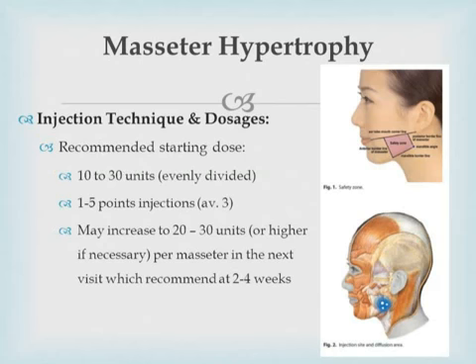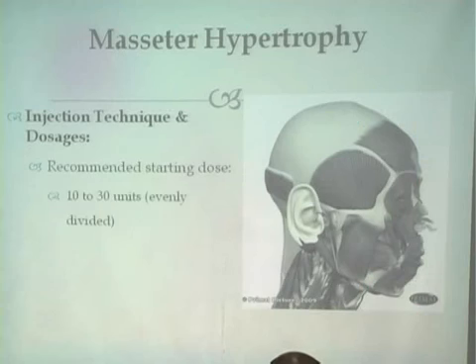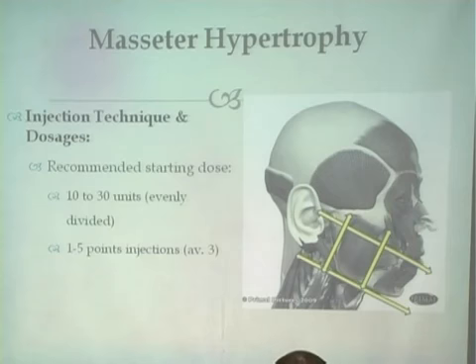The important thing is you have to spare the upper part of the masseter, which is located by the imaginary line drawn from the corner of the mouth to the earlobe. So for me, like this, I draw a square, palpate the muscle, and inject depending on the muscle size and volume. This is my picture marking the area.